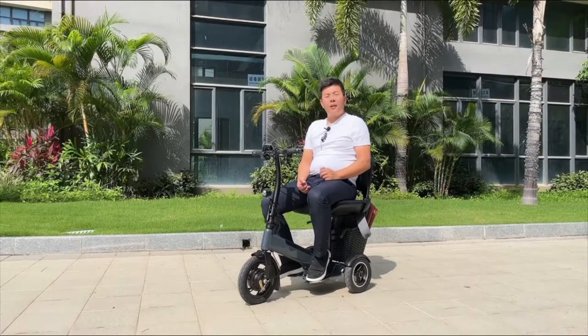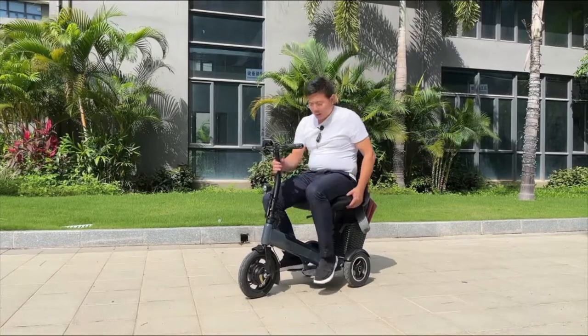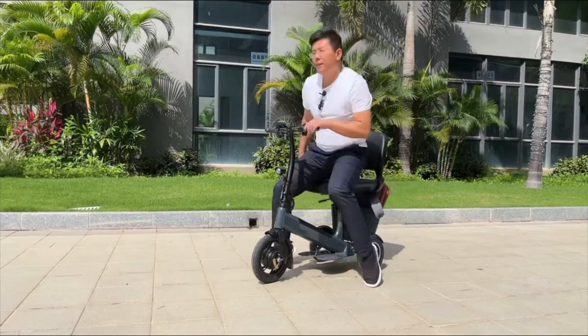This is the Frigo senior e-scooter. It's good for the disabled and old people. It's a foldable e-scooter — here it can fold, and also the seat is foldable.